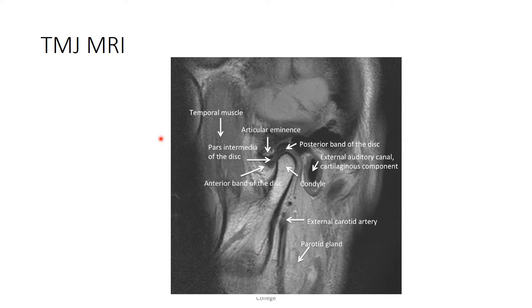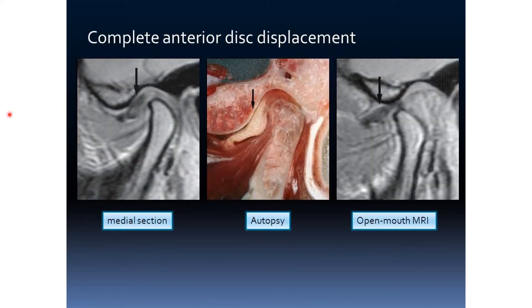This is an MRI of the TMJ region. You can see the different anatomy here — this is the condylar head, this is the external auditory meatus disc, the posterior part of the disc, the anterior band of the disc, and the middle portion of the disc, showing how clearly the disc can be visualized. Comparatively, this MRI image of the medial section of the disc alongside an autopsy image shows the condylar head and disc. On the open mouth MRI, the disc appears to be anteriorly displaced.